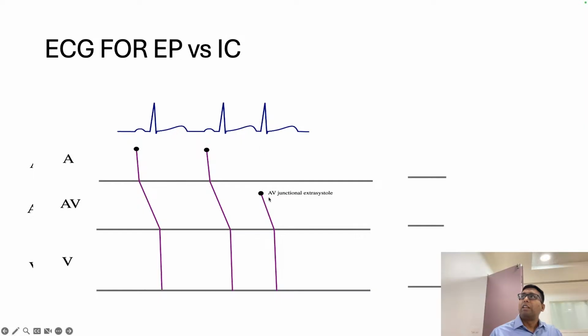Now, in this patient, our interpretation is it an APC, VPC, or junctional? What is the hypothesis? The first question is whether this is narrow or broad. Broad? Why broad? Both of these look the same, these are of the same duration. So it's narrow only. If it is narrow, from where can it start?